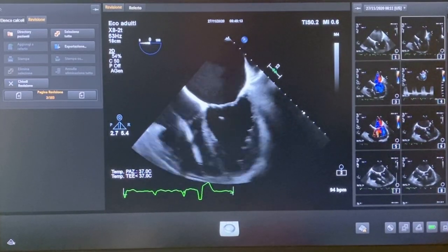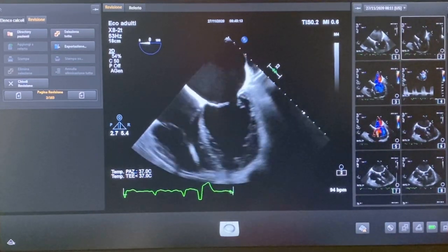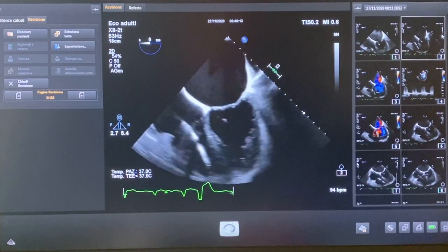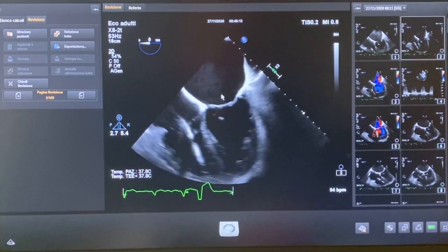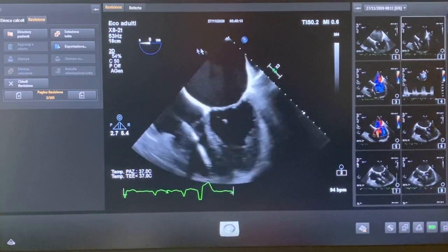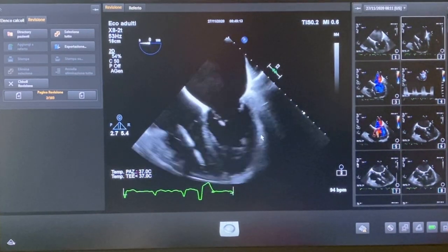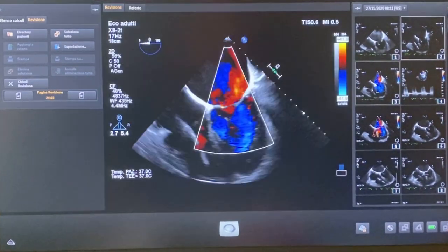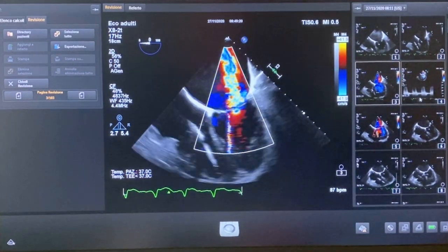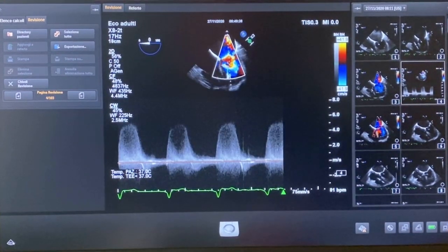When we evaluate the mitral valve at the transesophageal echo, we should evaluate it through different perspectives. We start with the mid-esophageal zero degree view, in which we can see A3, A2, P2, and P1. We can also see that the left atrium is dilated and there is a systolic dysfunction of the left ventricle. We then put the color on and see the regurgitation, which is in this case very central. We also put the continuous wave Doppler for the measurement of the VTI.